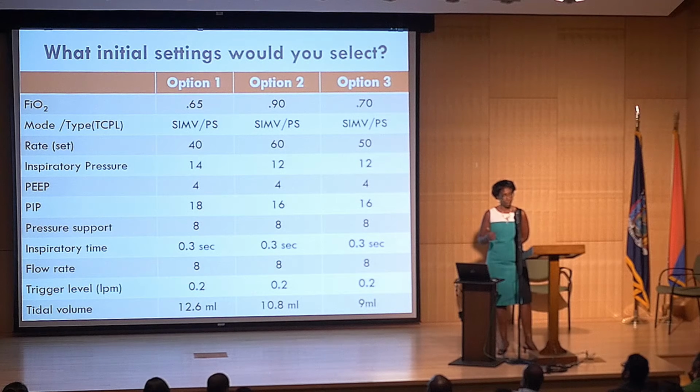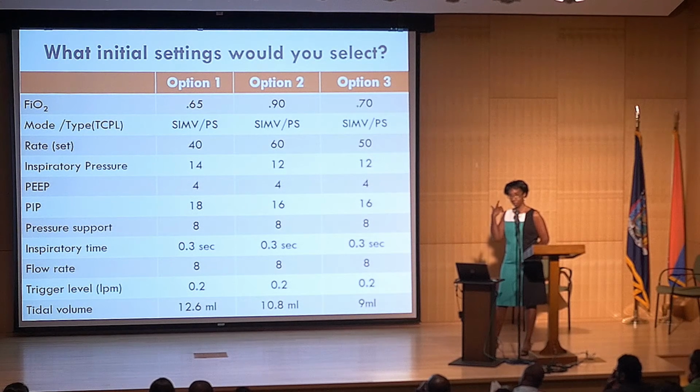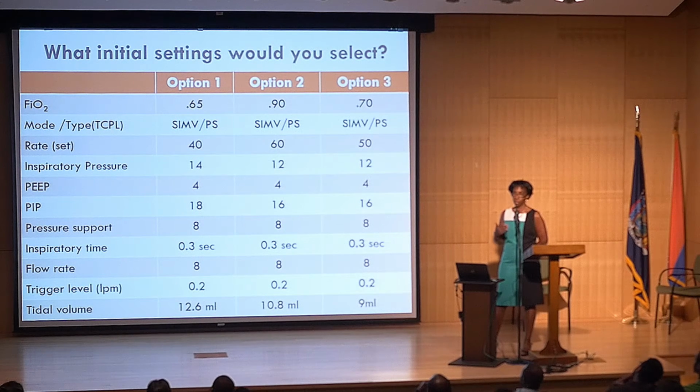So we know the baby is premature. Right? So if the baby's premature, you may have a problem with oxygenation. Okay? You may be concerned about oxygen toxicity. You may be concerned about ROP, retinopathy of prematurity, so that relates to the eyes, so you have to be careful about using too much FiO2. Whenever we ventilate a person, whether it's a neonate, a pediatric, or an adult, you're always thinking about barotrauma and volume trauma. So you're trying to use the lowest possible pressure and the lowest tidal volume for that particular person in order to have effective oxygenation and ventilation.